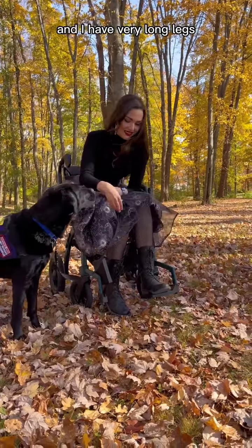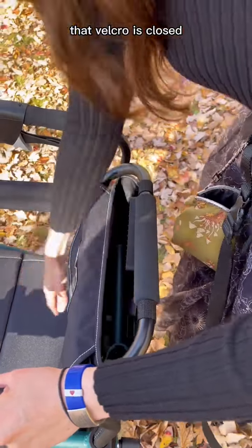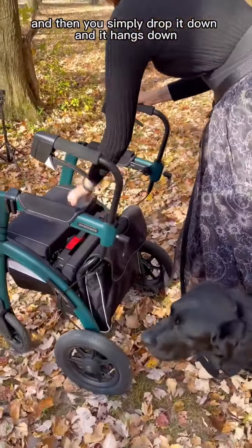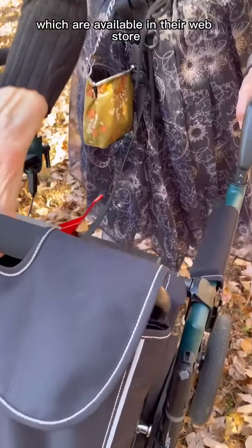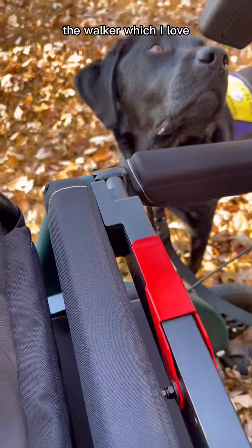It's very easy to convert back into a rollator — the legs just slide off, slide back into the back of the backrest, the Velcro closes, and it simply drops down and hangs. The backrest portion is fully removable. Also, if you purchase the additional clips available in their web store, you can put it on the front so you can walk more inside the walker, which I love.